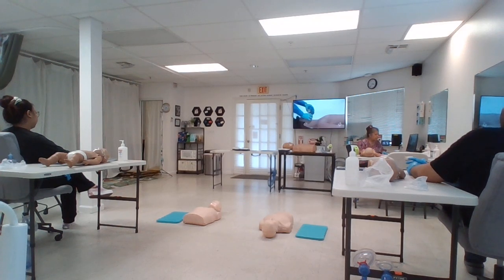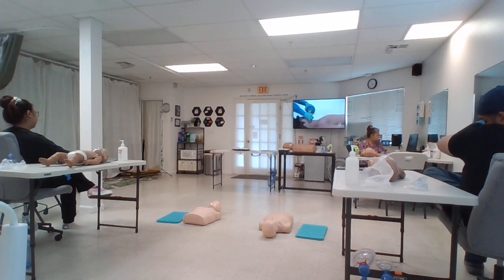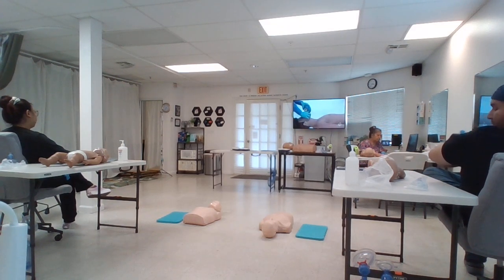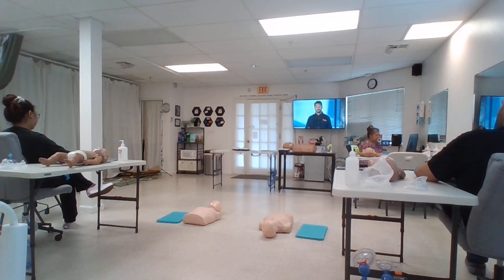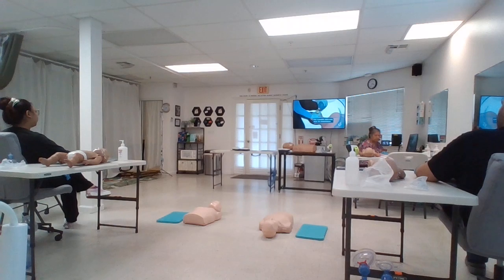If the chest doesn't rise with each breath, you're not providing adequate breaths. If you don't get chest rise, readjust the mask, reposition the head and neck, and try again to ventilate. And then, only if necessary, administer a larger amount of air, just enough to get chest rise. The critical points of delivering breaths remain the same for the bag mask device as for the pocket mask. Two breaths are given, each breath given over 1 second after every set of 30 compressions. Be sure to deliver each breath over 1 second, just enough volume to make the chest rise.